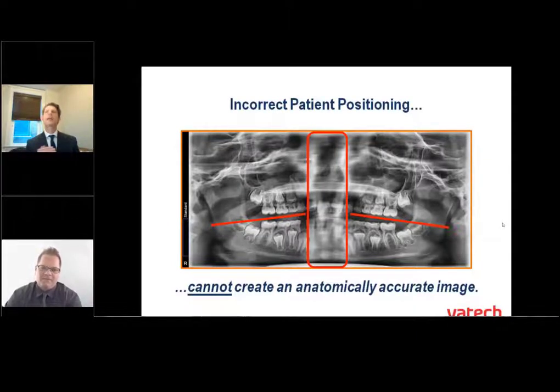Right. So due to the head being tipped up too high, it's collapsing the spine and causing that blurry anterior there. And this could be a couple of things, could be canine, but also here I notice how the condyles are tipped out too, with the head tipped up.